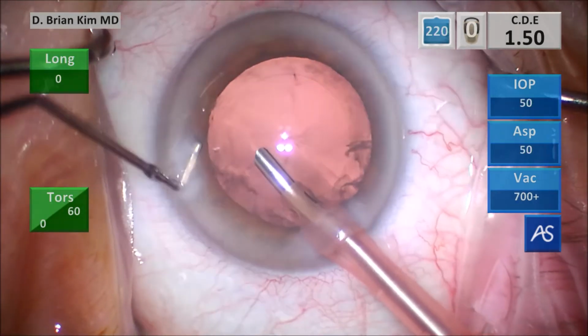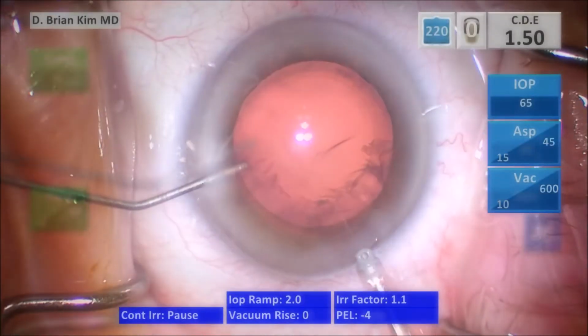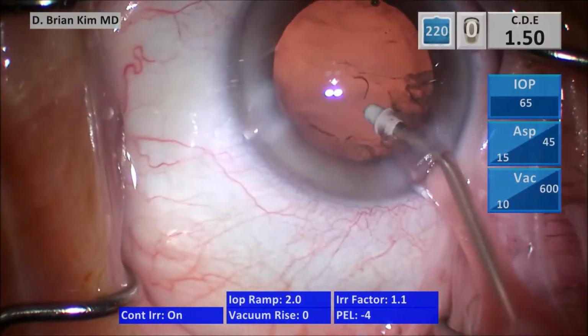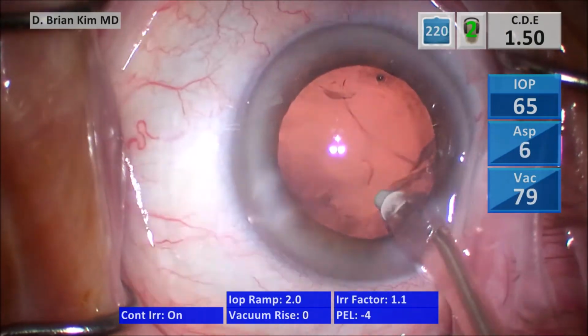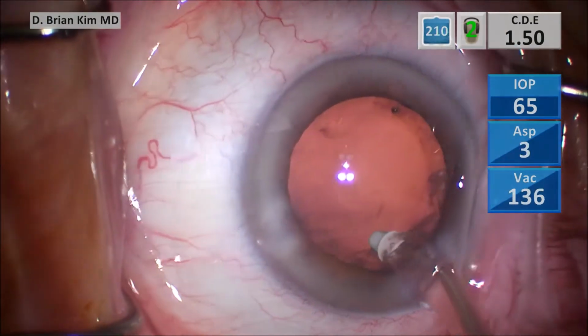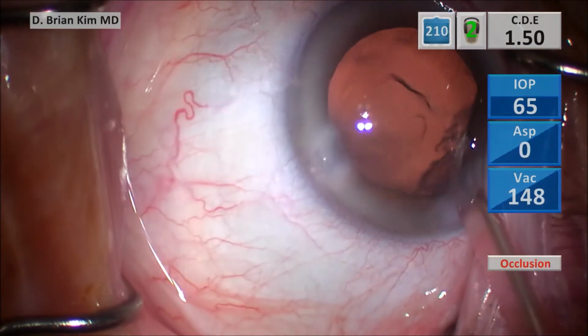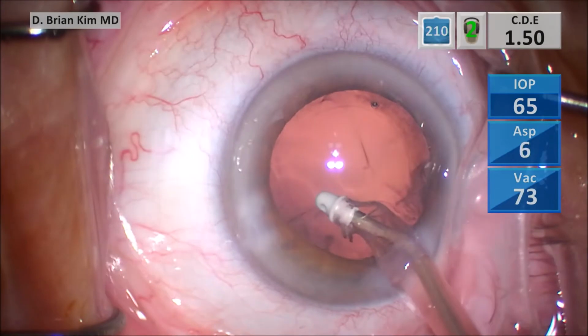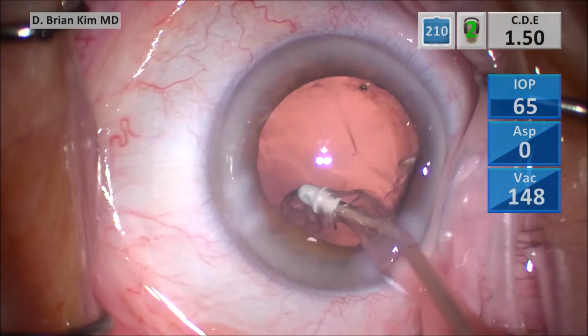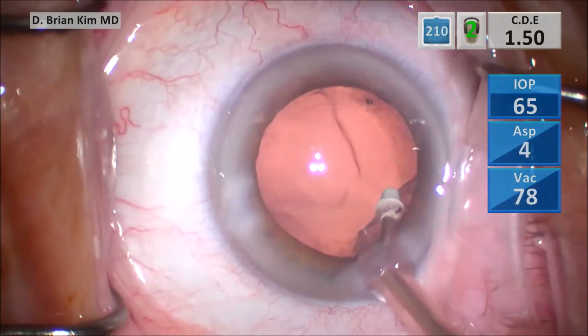Take the chopper out, push BSS in, take the phaco tip out, and I go in with the I/A handpiece. I always start sub-incisionally, removing the cortical material, sweeping side to side, trying to peel it. By peeling it this way, you're able to get a cleaner removal of the cortical material and less likely to have any remaining fragments there. I go to the left side and then now the right side, peeling it from front to back.